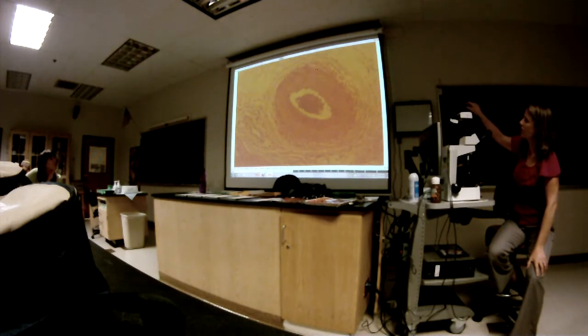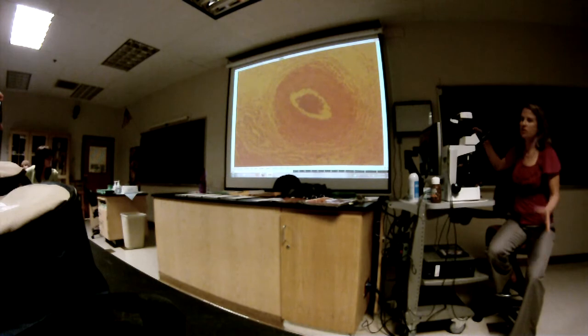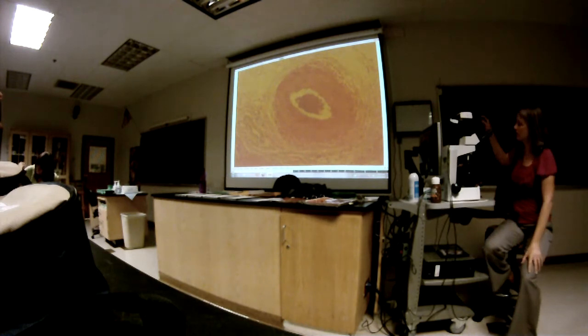And so this is the outermost layer. What is this outer layer? Yeah, that's the adventitia. Okay, and then here you have this, see the smooth muscle? What's the name of that layer? Yeah, it's the tunica media. So it's the three main layers, just like we've been seeing.